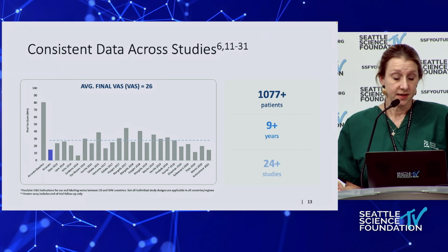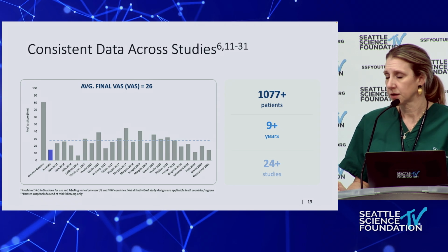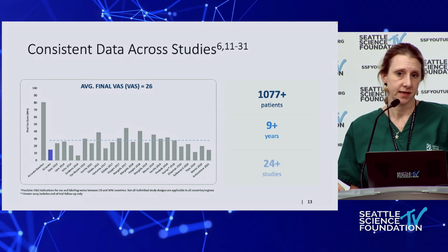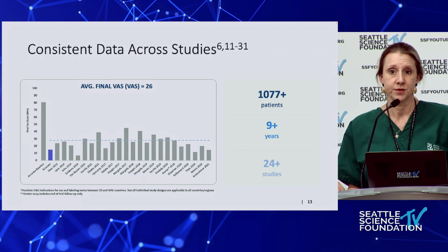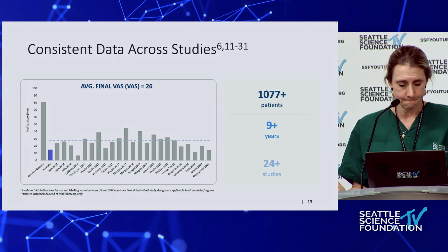So there have been a lot of studies performed. This is just a reference that you could pull up at another time, but the purpose of this slide is just to indicate that this is a very well studied and restudied procedure over a long length of time.